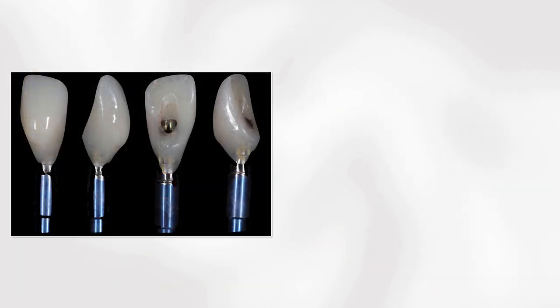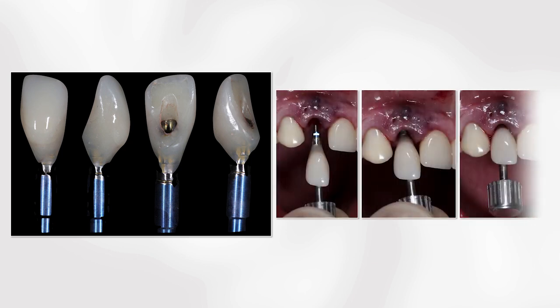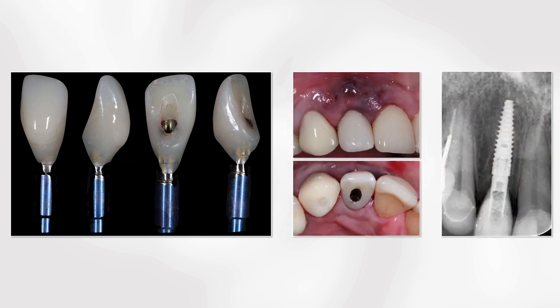Now it's time to make the provisional using the veneer and composite resin. After finishing and polishing, we check this provisional restoration onto the implant. And of course, we left this provisional restoration shorter than the neighboring teeth to protect it over the implant from the occlusion, from the antagonist arch. Pay attention to the correct three-dimensional position of this implant.